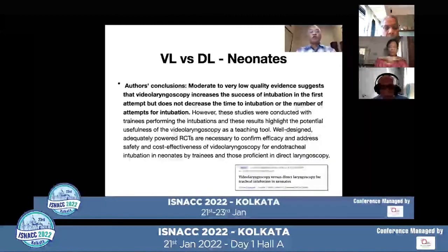For video laryngoscopy versus direct laryngoscopy in neonates, the authors concluded that though there is moderate to very low quality evidence suggesting that video laryngoscopy increases the success of intubation in the first attempt, it does not decrease time to intubation or the number of attempts for intubation.